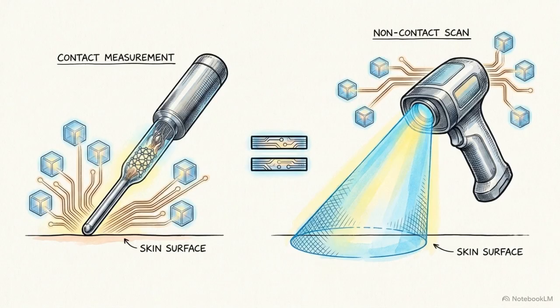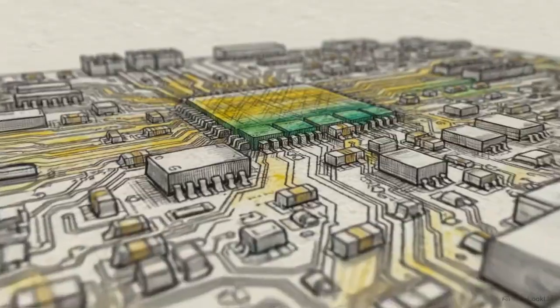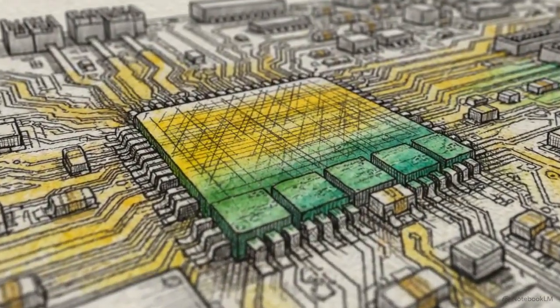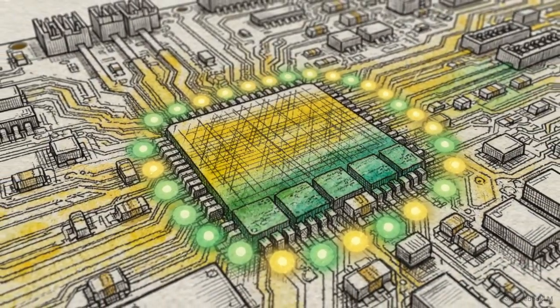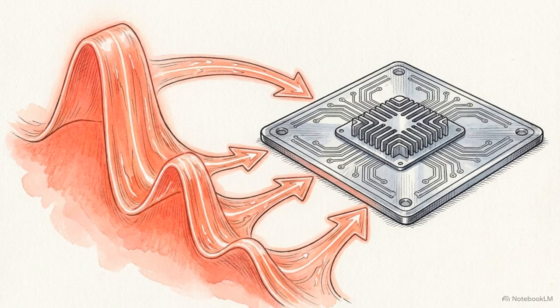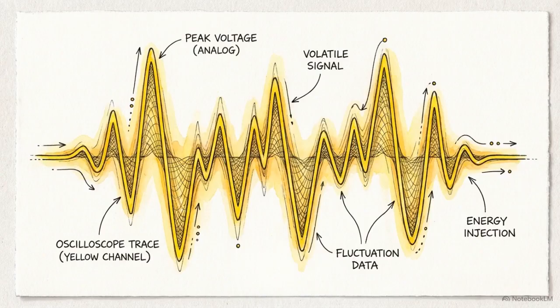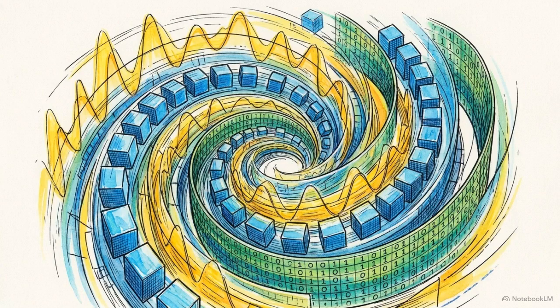Even though the sensor collects radiant energy instead of conductive heat, the underlying system is identical. The microchip forces this data through the exact same rapid electrical-to-digital translation. Whether utilizing physical contact or infrared logic, the system relies entirely on forcing physical laws to speak digital math. The sheer computational velocity required for this is staggering. The entire sequence, absorbing energy, altering voltage, slicing the signal into digital math, and pulling coordinates from a table, loops multiple times every single second.